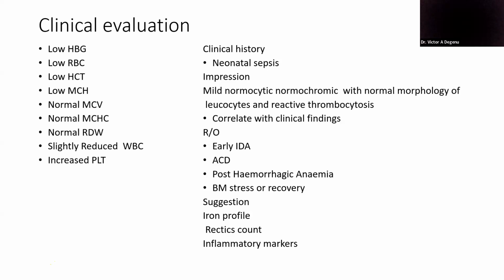Exactly so. What we are doing is the film comment to confirm or to disprove what the machine is giving us. That is the essence of it. So if you have any disagreement between the film and what the machine gives you, then you have to go back, check all the things, do your quality control and check the various things, and then you definitely arrive at something substantive. Now that will tell you that what you did was actually right. So you're not far from wrong. Thank you.